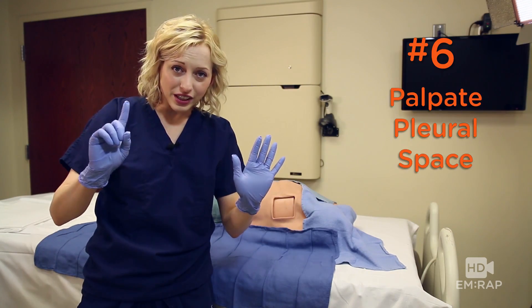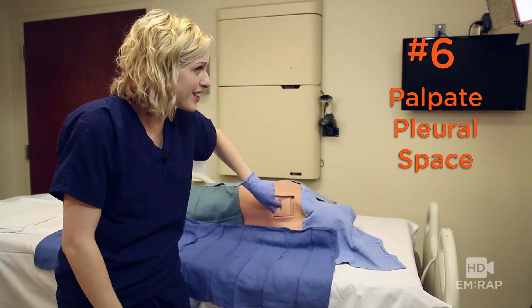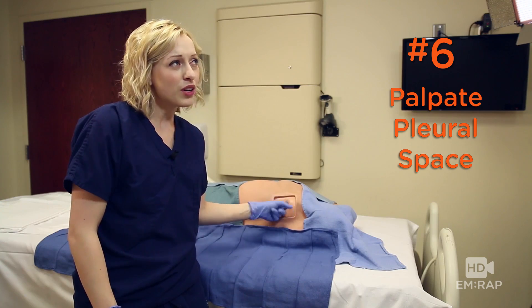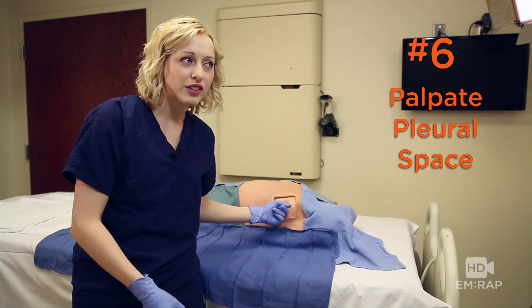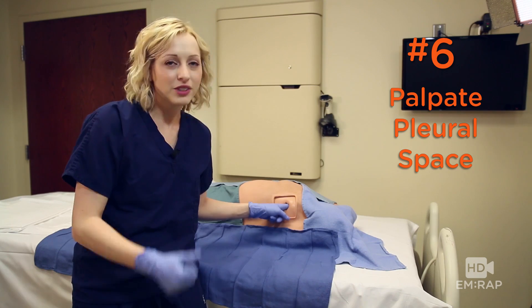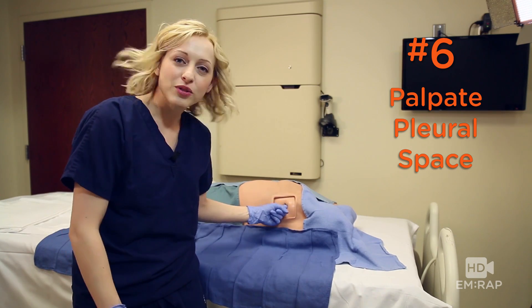And finally, number six: make sure you actually get tactile confirmation that you're in the pleural space. You don't want to create a large subcutaneous tract. Make sure you feel it — there's a rib, there's a lung. Yep, that's the right spot.